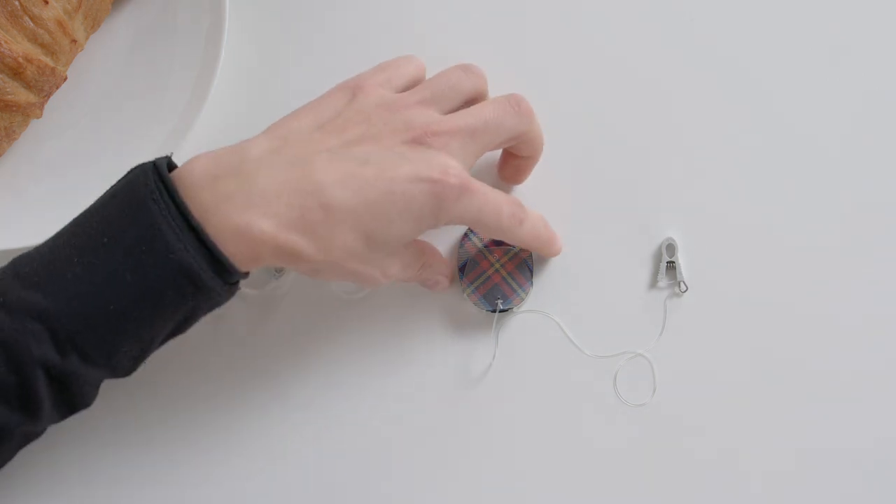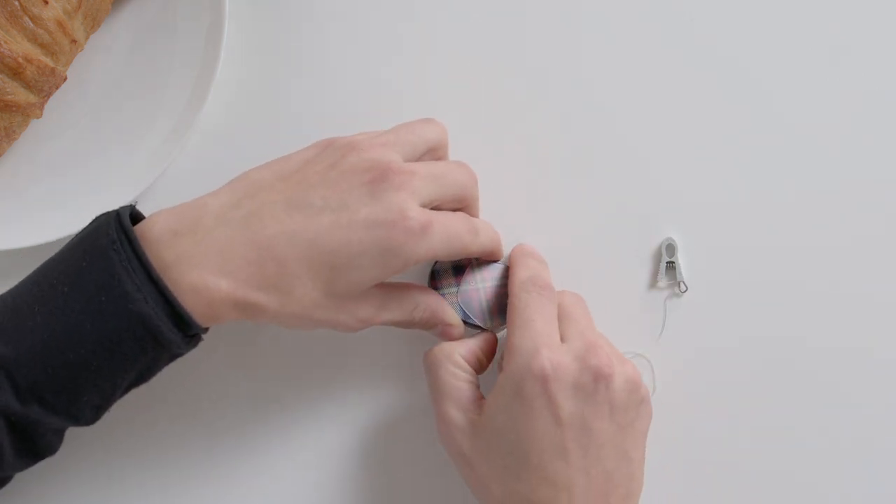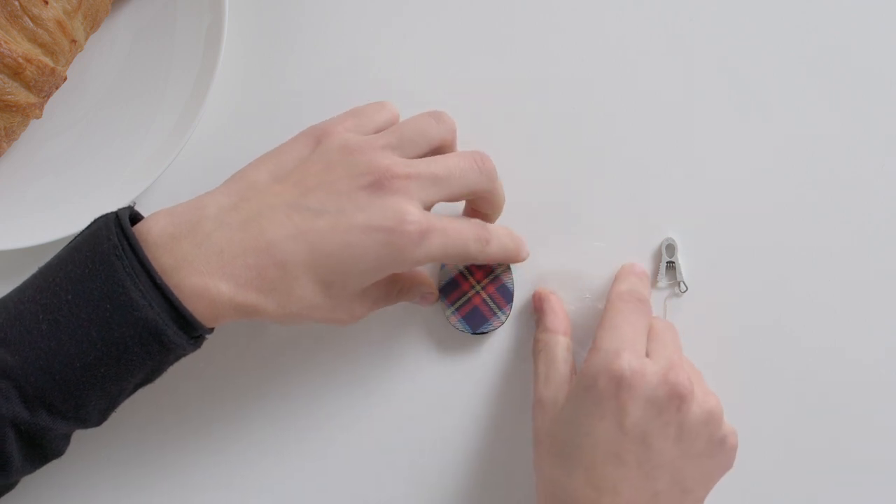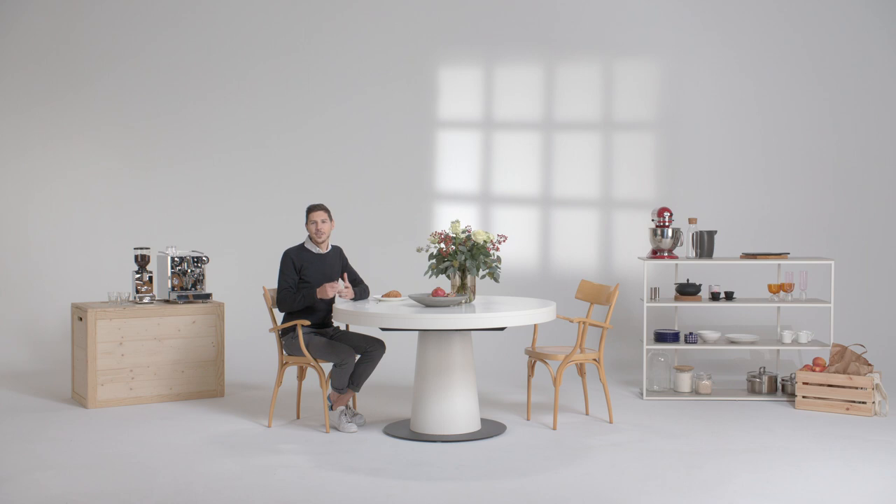To remove the clip, insert your fingernail under one side of the cap and gently lift it off. Now you can snap on your attachment clip and go about your day.